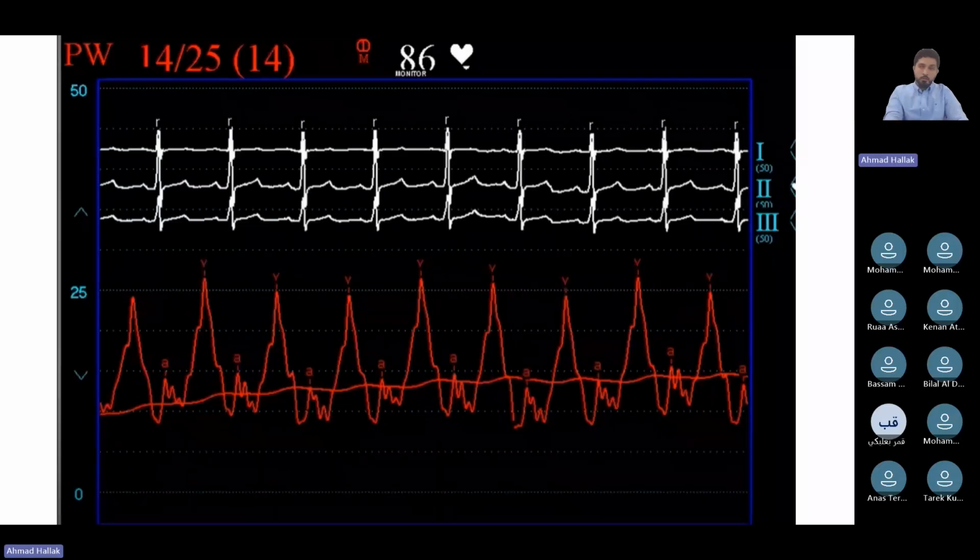Number one, when you're considering repair of the mitral valve, you need to know what the baseline V wave is going to be, so that you know after the repair, has it been repaired? If it's surgically repaired, the majority of the time the surgeons put in a fresh new valve, and it works very well. But when you're doing something like a MitraClip, you really depend on the change in the parameters to say, was this successful or not?